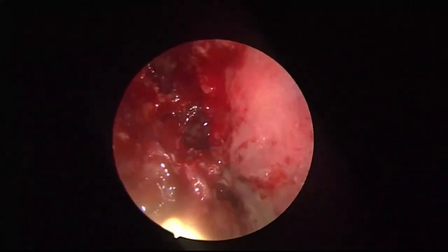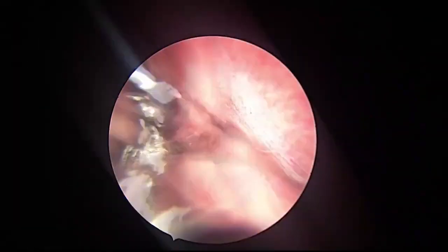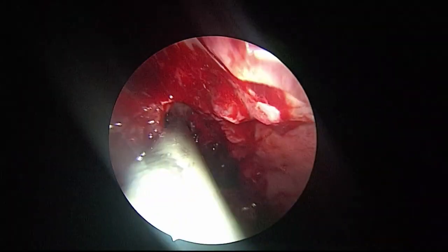To be sure that there is no leak, is it? No, no, no. This cannot perforate the dura. This is a jet. If you're not sure, suppose you have created a leak, and then do this. Wait. See the final picture now with the 0 degree.